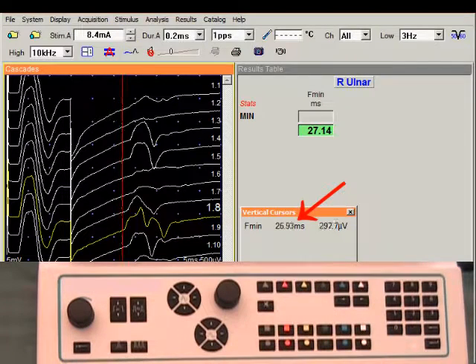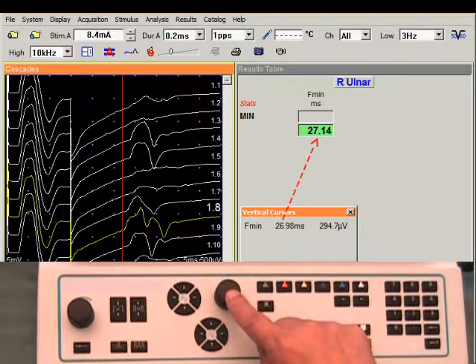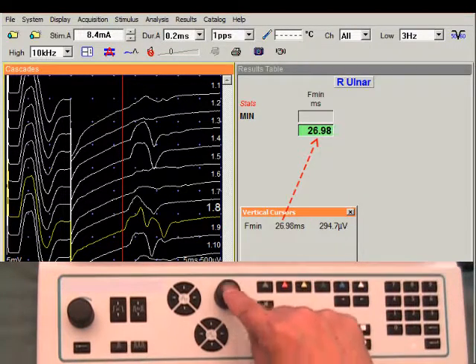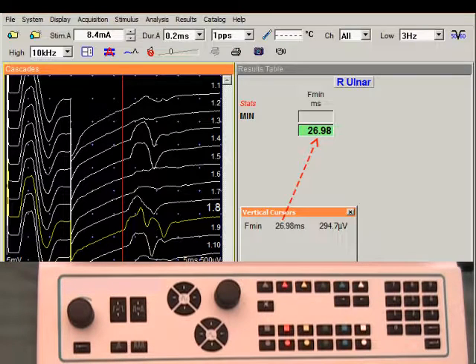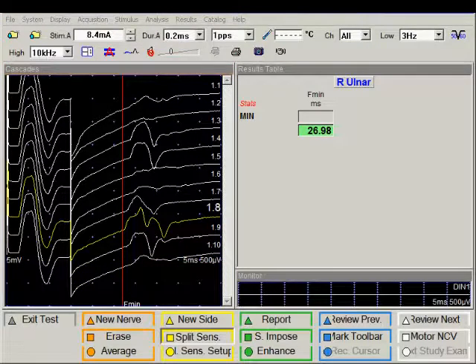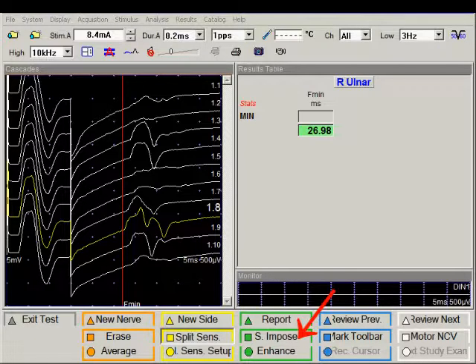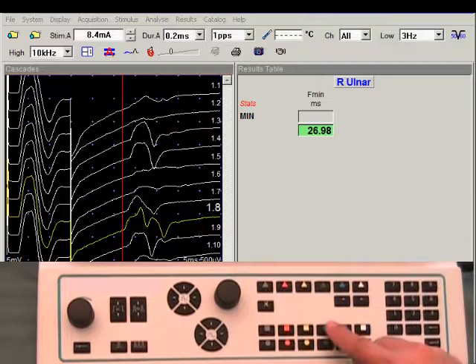When it's set correctly, press the button to update the results table. We can look at our F-Waves in the superimpose mode by pressing the superimpose key, the green square key.